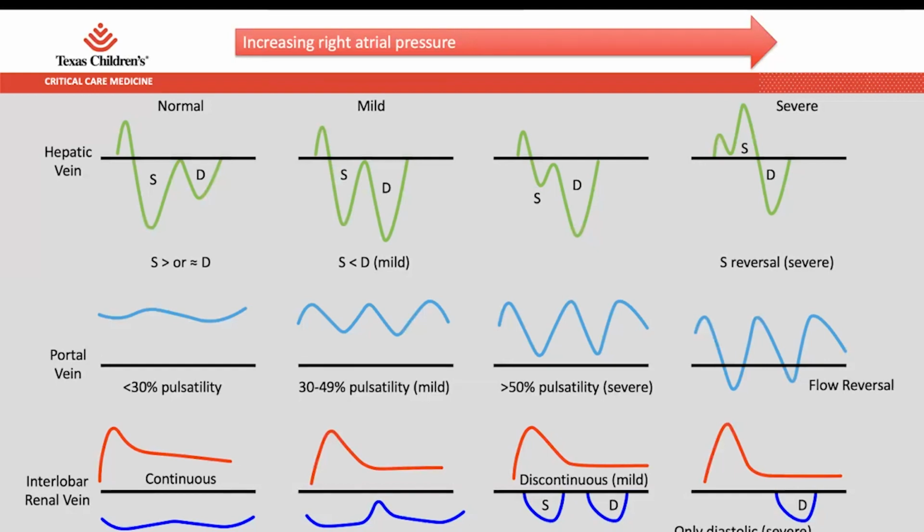And for those of you who do echo know that this is not just an isolated phenomenon with venous congestion. This is also something that happens when you have tricuspid regurgitation and other forms of RV failure.